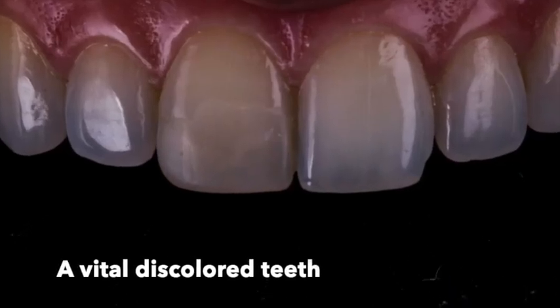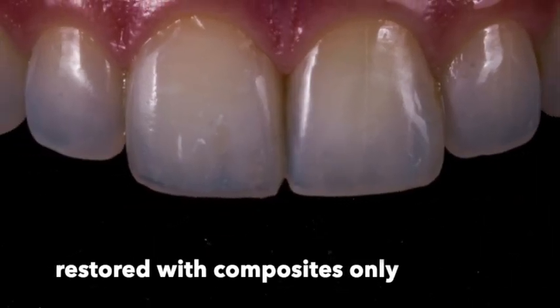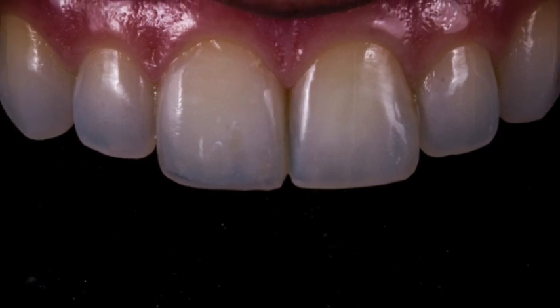A 30-year-old female patient came to our dental clinic unsatisfied with her tooth discoloration. The preparation of the tooth was 0.5 mm thick across all the labial area, and the incisal area was removed with the old restoration.